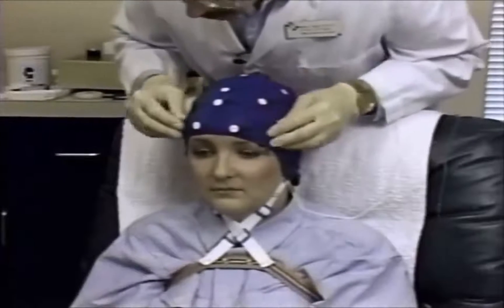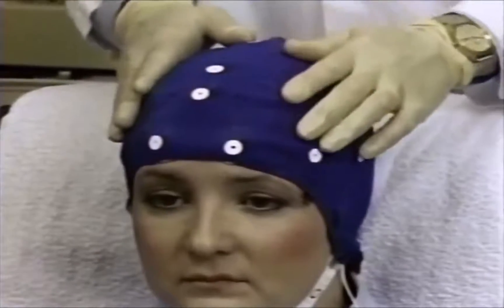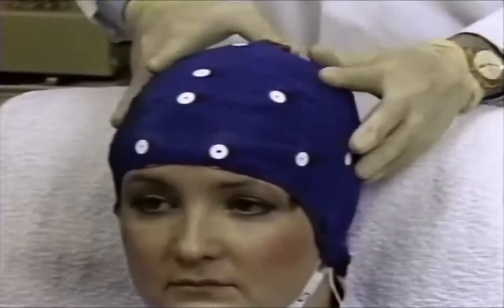Work each electrode onto the scalp to move excess hair from beneath the electrode mount. Make sure that the cap is centered on the head and fits properly.